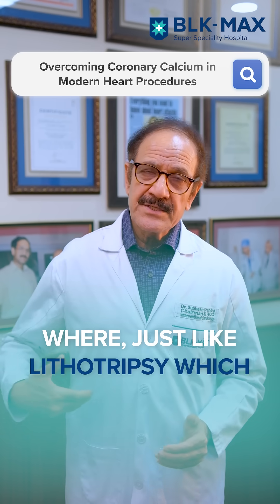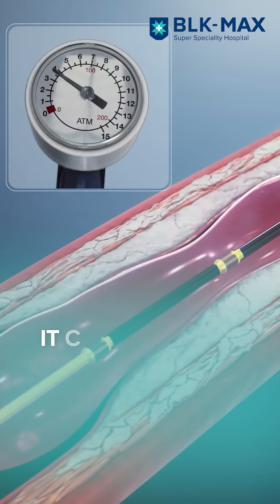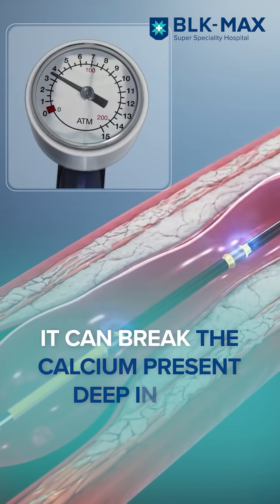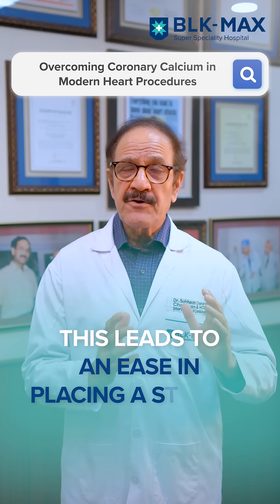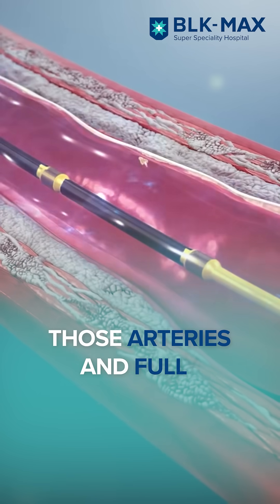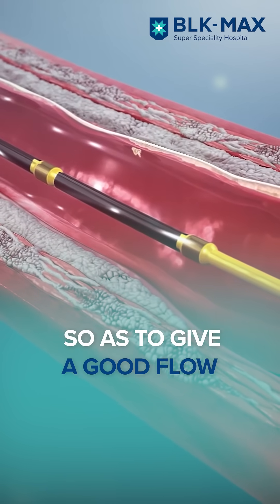The other option would be IVL, or intravascular lithotripsy, which — just like lithotripsy that breaks stones in the kidneys — can break the calcium present in the wall of the artery, deep inside the wall. This leads to an ease of putting a stent in those arteries and fully expanding it, so as to give nice flow to the muscle of the heart.